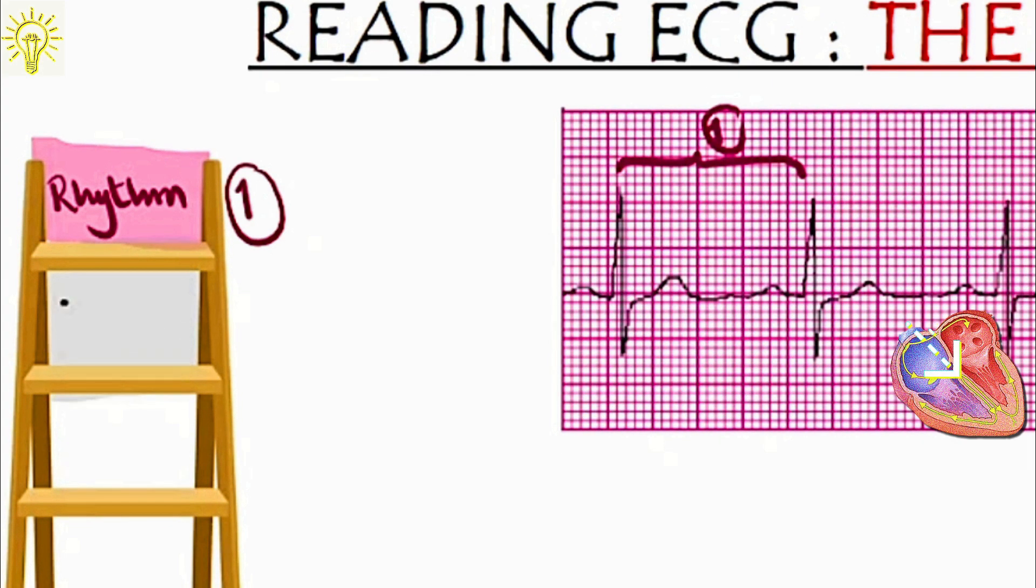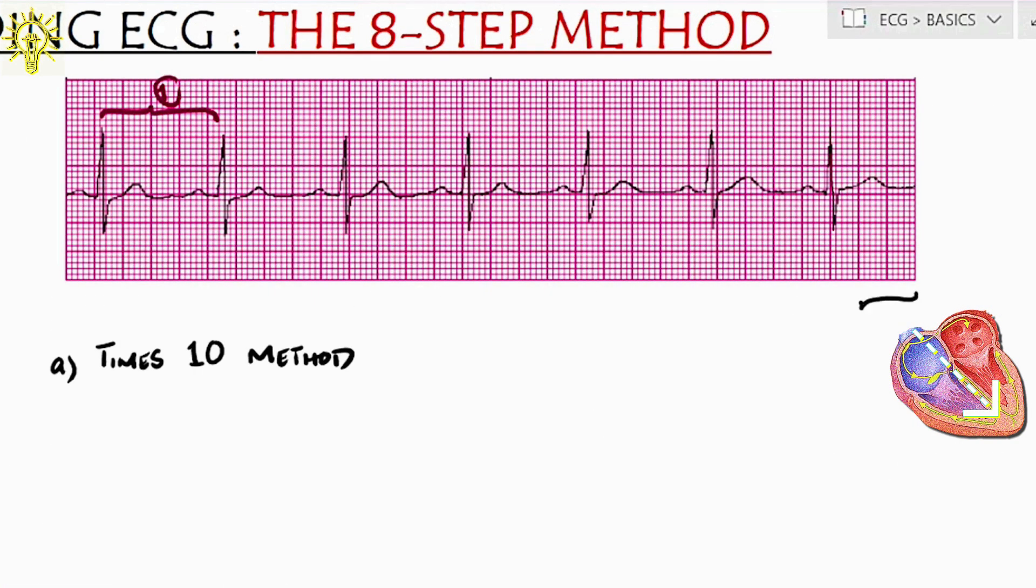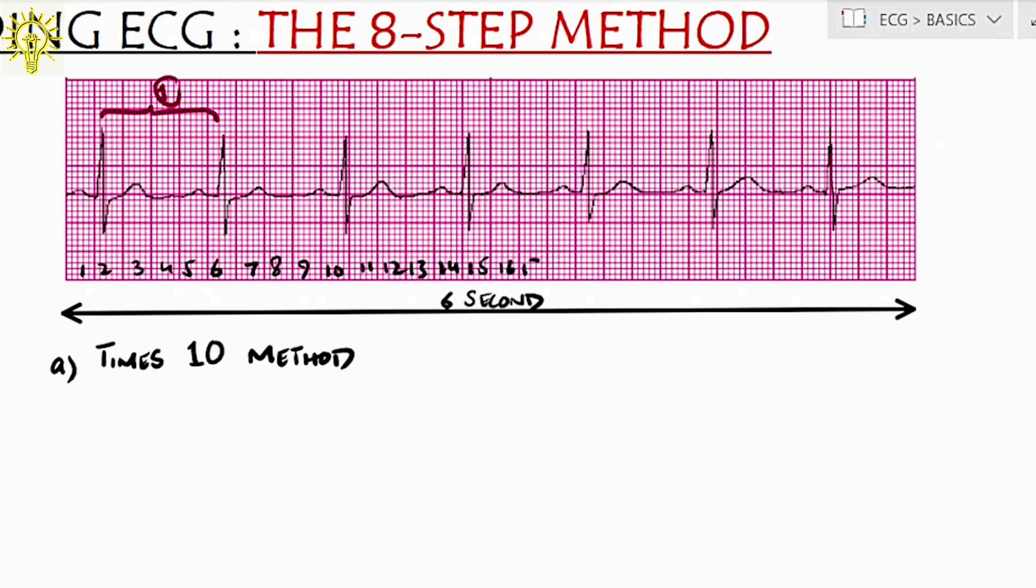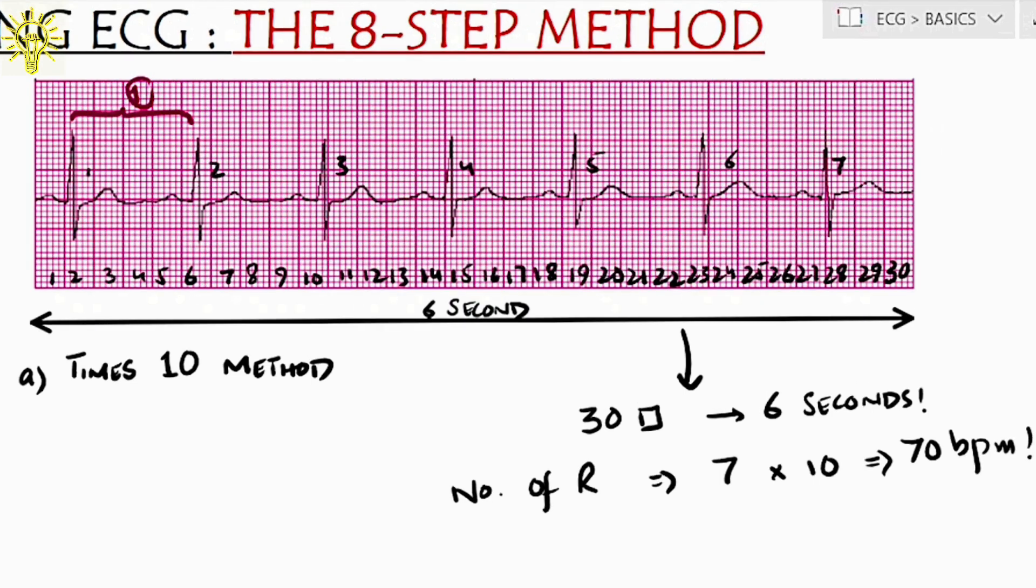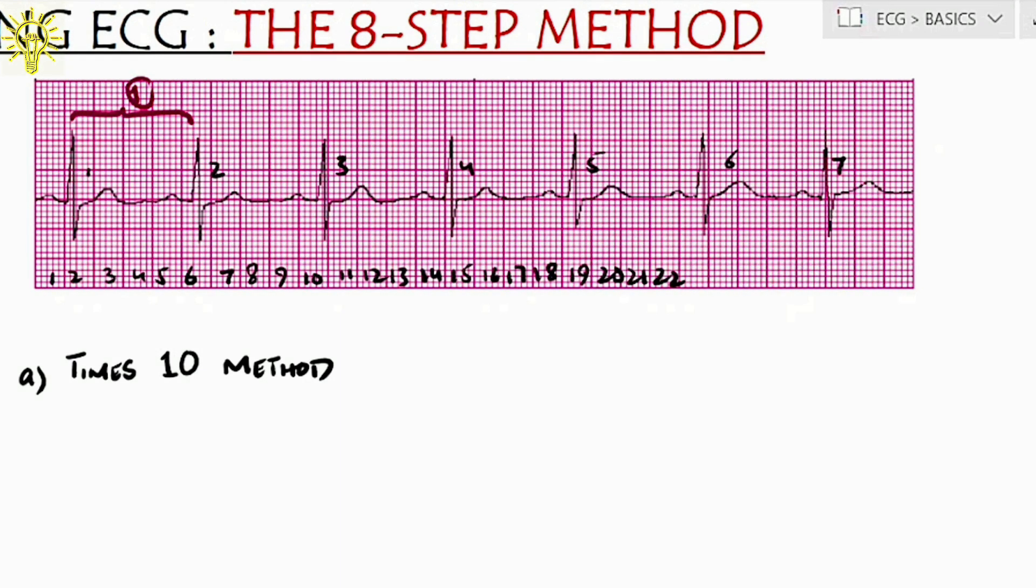Step 2: Check the heart rate. There are many ways. I'll show you two methods here. Number 1: Times 10 method. Remember in episode 2, we showed how 5 large boxes make 1 second? Let's take a 6 second strip, meaning 30 large boxes. For ease, I'm labeling from 1 to 10 to 15 to 20 to 25 to 30 large boxes making us 6 seconds on strip. Now, note number of R waves in this 6 second strip. 1, 2, 3, 4, 5, 6 and 7. 7 times 10 equals 70 beats per minute. So, it is called times 10 method. This method is mostly used for irregular rhythms.